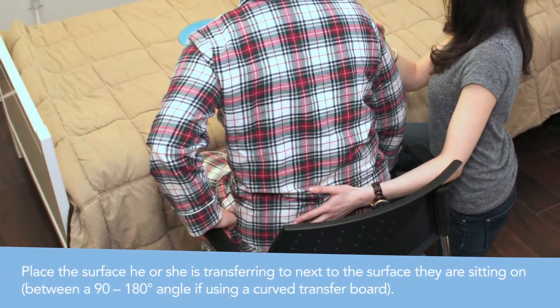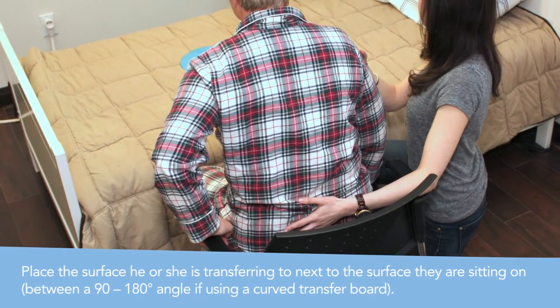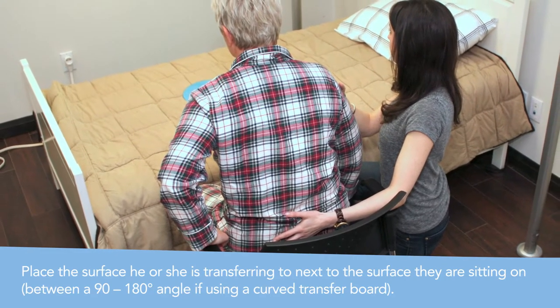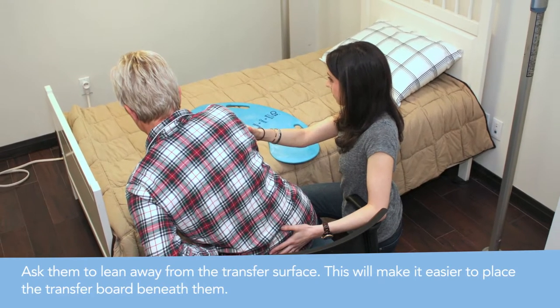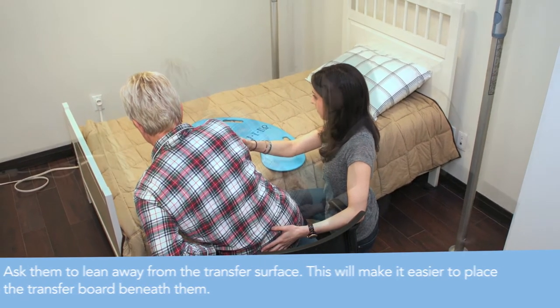Place the surface the person is being transferred to next to the surface they are sitting on, between a 90 and 180 degree angle if using a curved transfer board. Then, ask the person to lean away from the transfer surface. This will make it easier to place a transfer board beneath them.